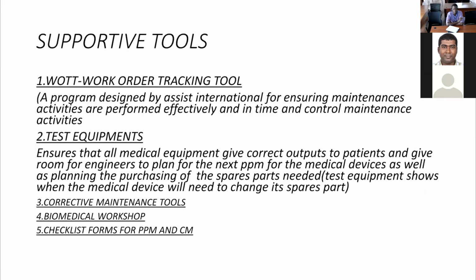So in that slide you have seen the progress which we are in now, the status of medical equipment which are working. So you will see now here the supportive tools which have given us that victory to have that high percentage of medical equipment working. First, number one, we are having the order tracking tool.